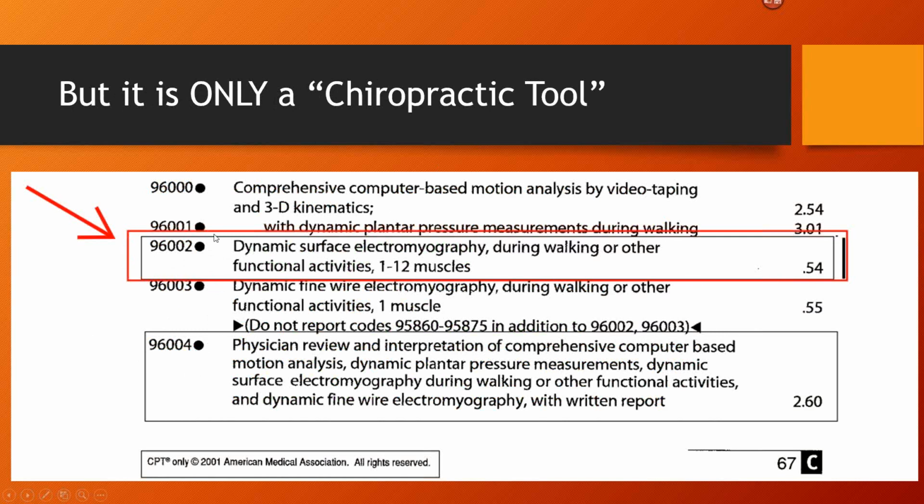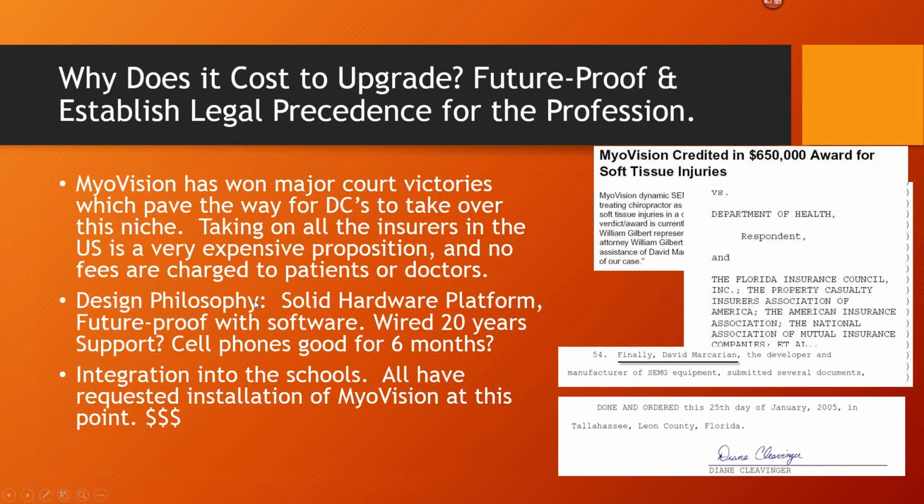I'm not here to tell you what to do, but this is about 50 to 75, and this is about 150, I guess, and that's what they come up with. And so, like I said, it takes about the same time as range of motion, slightly longer. And so there's a cost upgrade depending on how old your system is. And just so you know, the reason is it's not a software update. This is a major change.